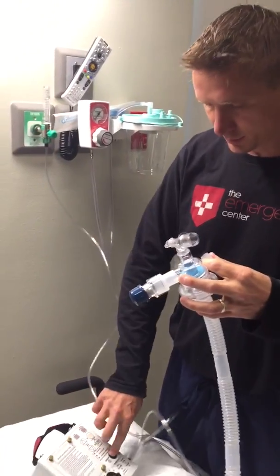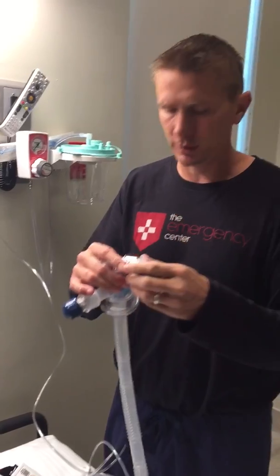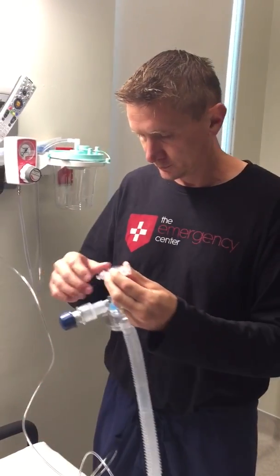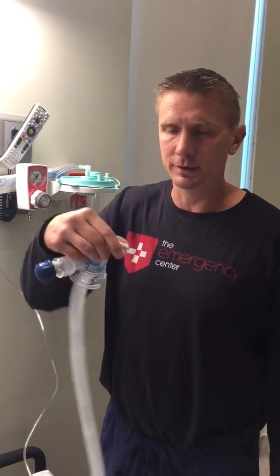We're getting an alarm because when I undid this I put my hand here and it felt too much pressure. So once you've got this, take that off, put your ET tube on, hook that right to your ET tube, and you should be good to go. Thanks.